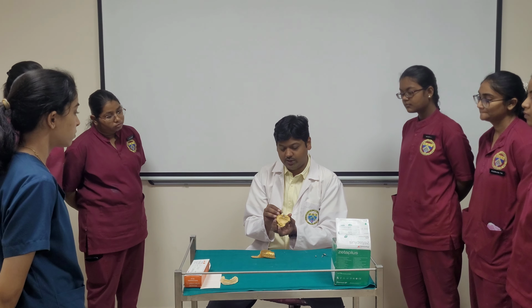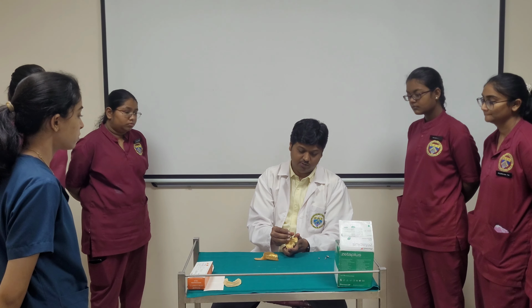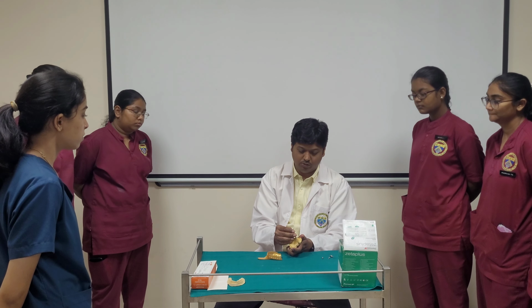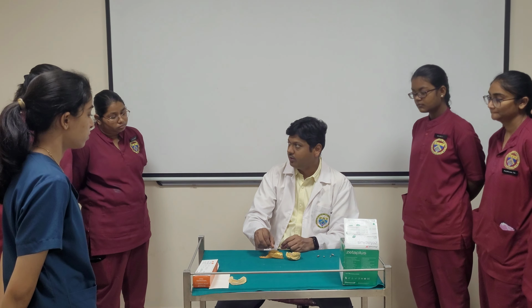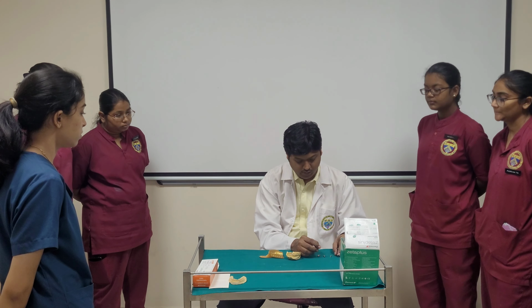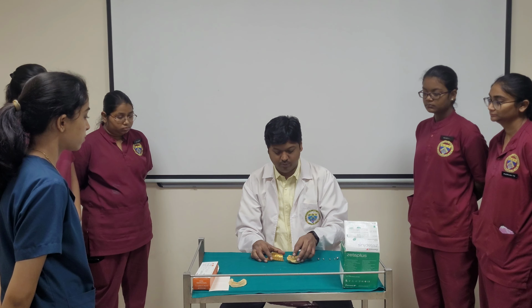So one side it is serrated, other side it is flat for the easy guidance. So once the impression is set, to take out the impression, take out your transfer coping and place it back inside the impression in the same direction. So now I will give you a demo for closed tray impression.